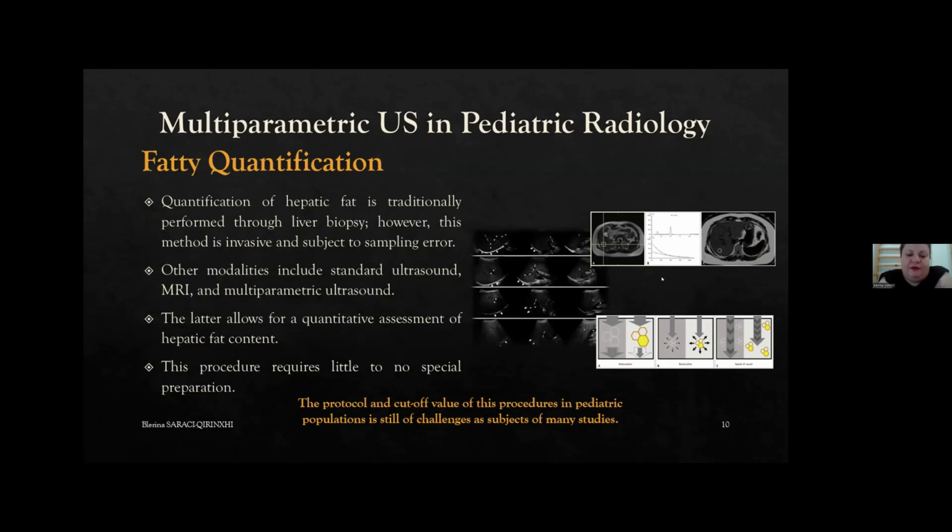This procedure requires little to no special preparation, is not invasive, and is quite easy to perform for the whole population and for children even more. The protocol and the cutoff values for this procedure in the pediatric population are still not well confirmed, so it's a challenge and a subject of many studies in the field, and we can do a lot of research to conclude with a better cutoff for this population. Here is a schematic view of what we are saying.